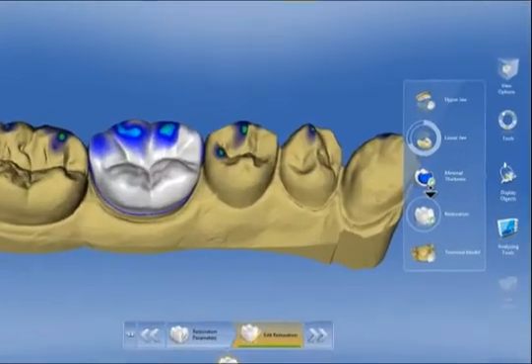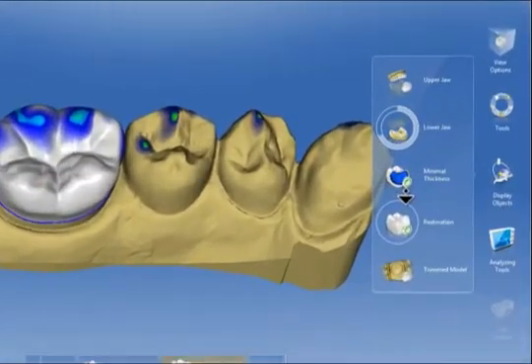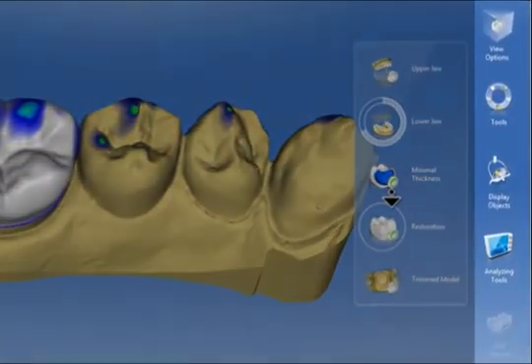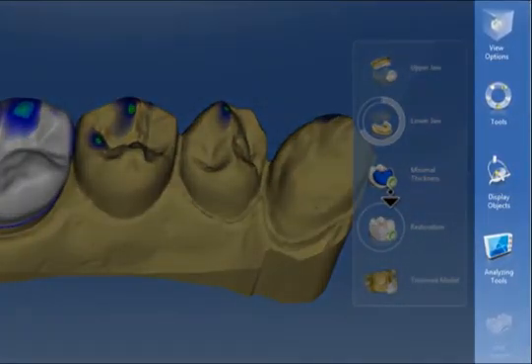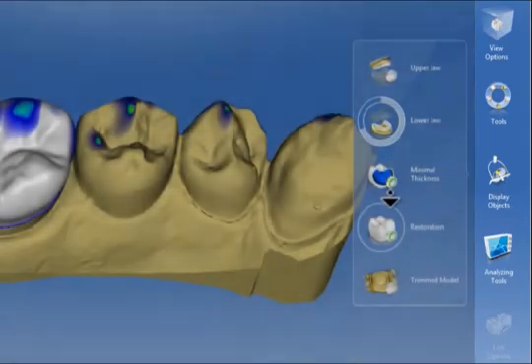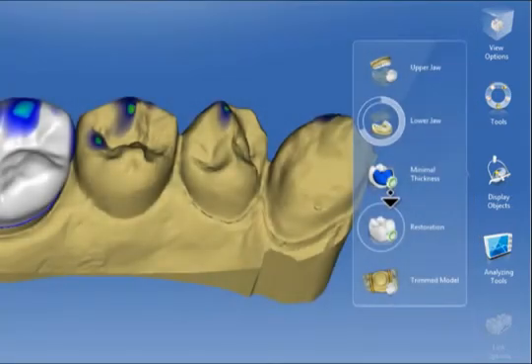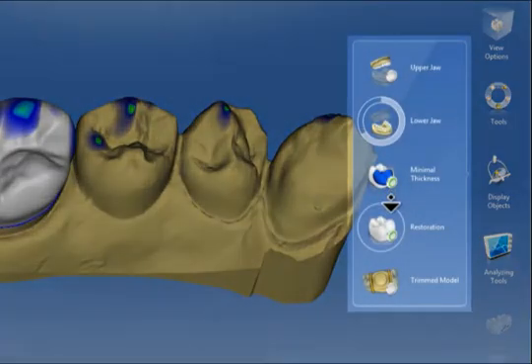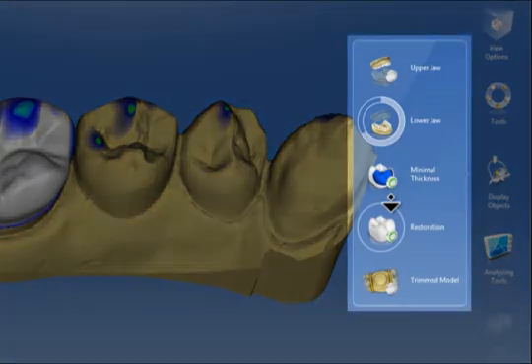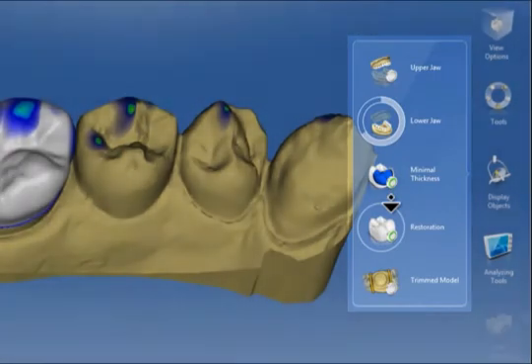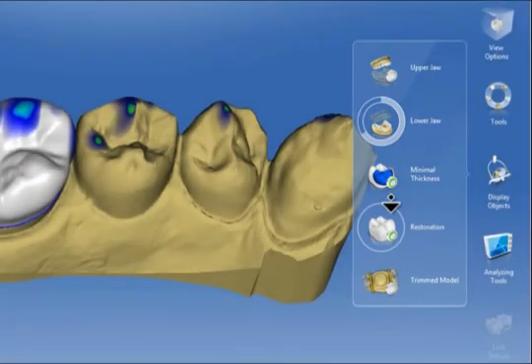On the right side of the screen is the side panel. The side panel contains various options for displaying and modifying 3D restorations or models. In the menu opened here, it also shows the additional menu for displaying models.